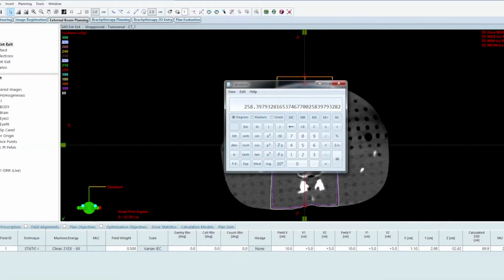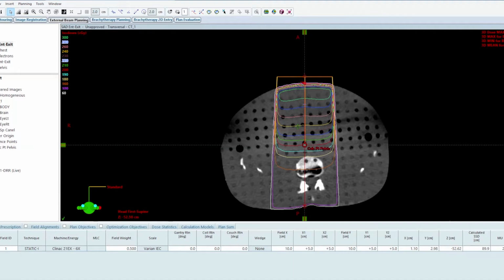However, I also have that inverse square factor component. Divided by 1.03 is my standard inverse square for calculation to isocenter, because my inverse square factor is source to calibration distance 101.5 divided by source to calculation point distance 100, squared, and I get 1.03. So my calculated monitor units are 200 divided by 0.774 times 1.03, which is 251, and the computer told me 253, and that probably has to do with some of the missing scatter in the slope surface, from the phantom surface.